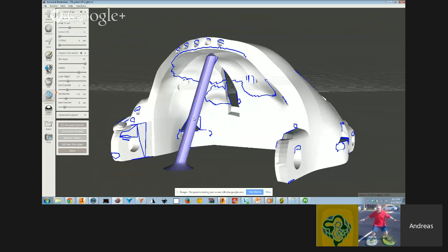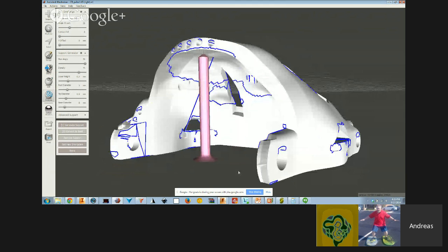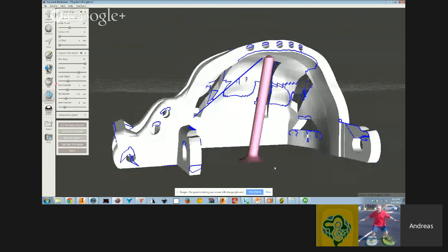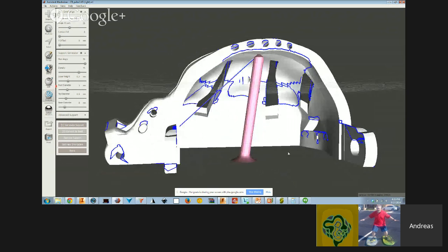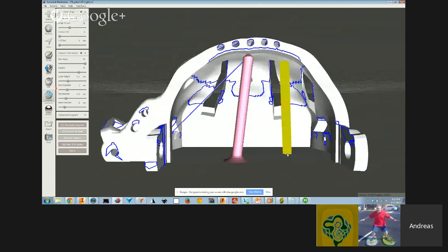Okay, let's say I still don't want that, and I want it specifically in a spot. Let's Control-click both of these guys. I can just simply click and drag down to the grid, and it'll add it right there. Very cool. So now I'm just manually adding supports, right? And it's like, okay, I would just want that. I'm not going to fiddle with 50 sliders to get this, right? So we do have the ability to do manual support. And you can come in here. Well, let me get a better angle on that.